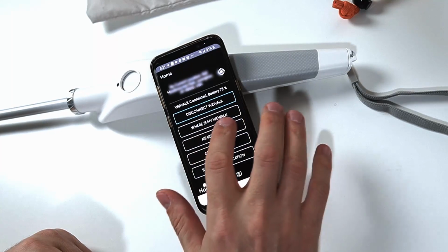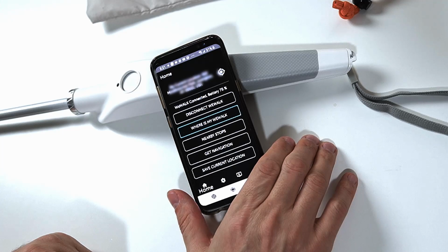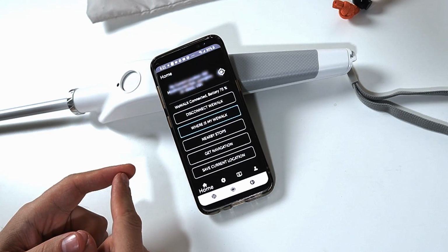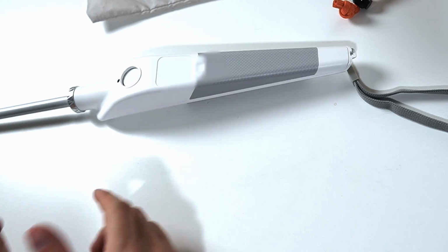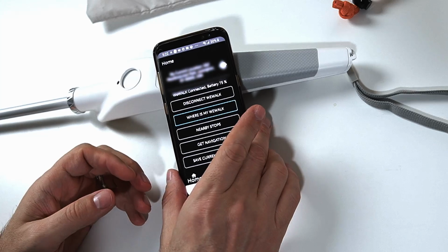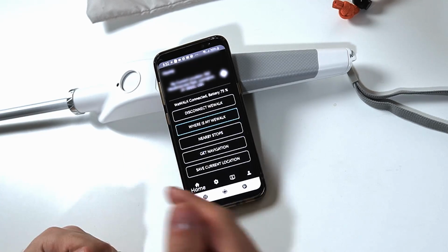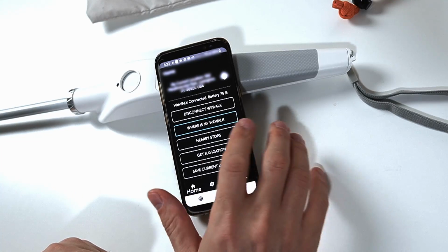So now we have a couple more options that have popped up in the app. Where is my WeWalk button? If I click that, then my WeWalk will start to play a tone. It just played a little tone letting me know. So if you lose it, you can use your app to find it. And it works the opposite way as well. On the WeWalk cane, you have the option to find your phone, and your phone will start to ring if you do that.